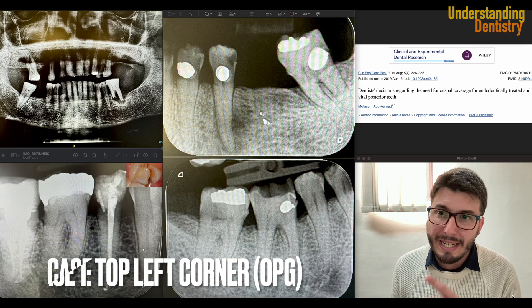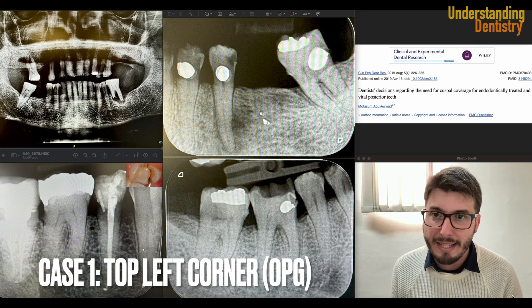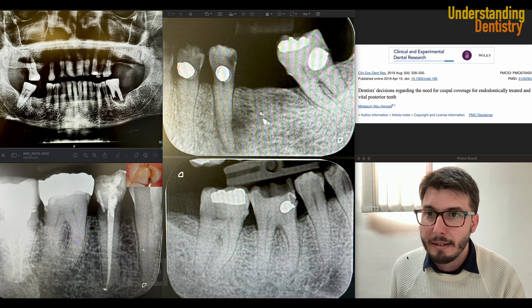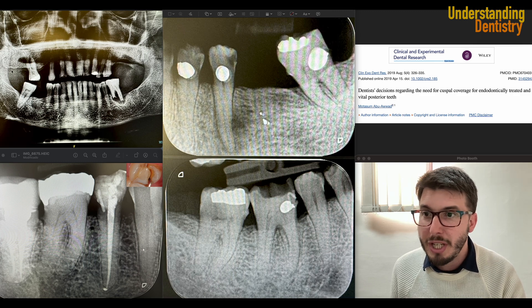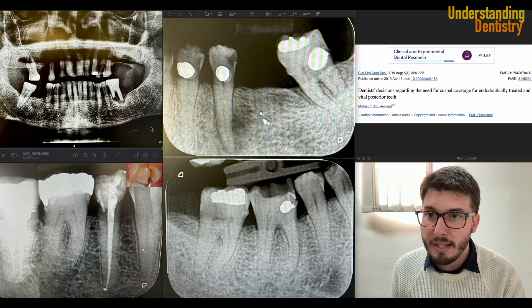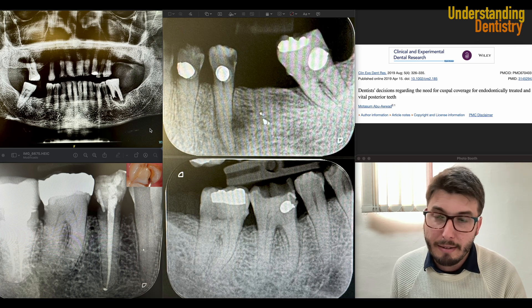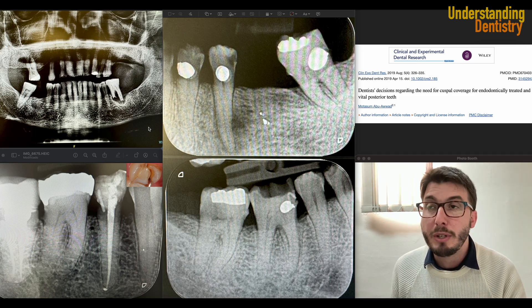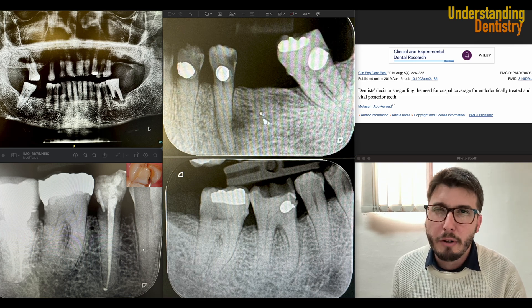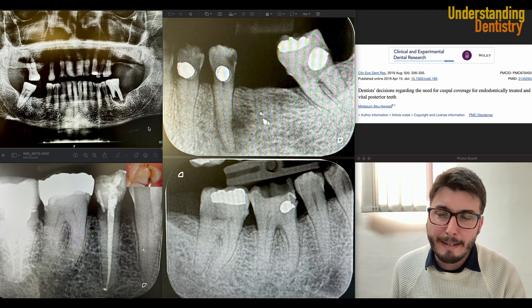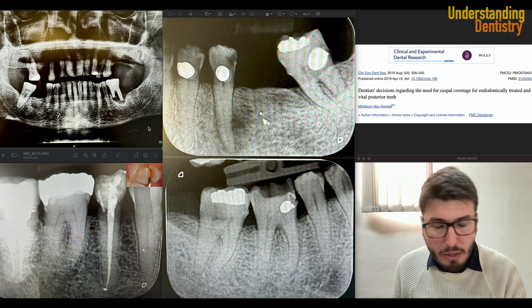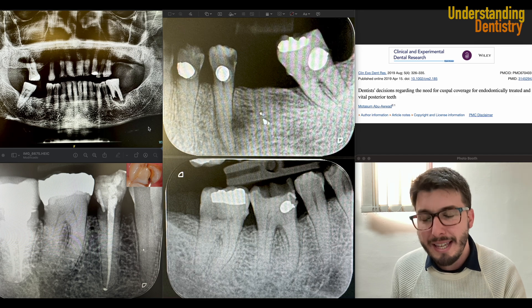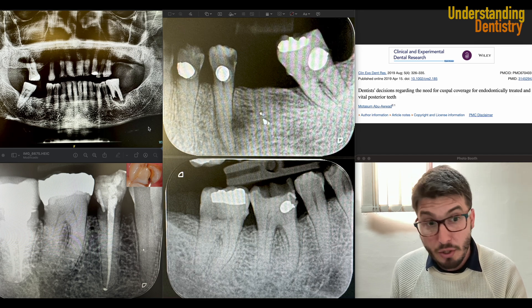Without further ado, let's start with the case on the upper left corner of your screen. So this OPG that we are seeing here — and of course there are a lot of things to be done here. We don't have the clinical information, but let's try to discuss based on this OPG, because from this OPG we can actually take some very important decisions.